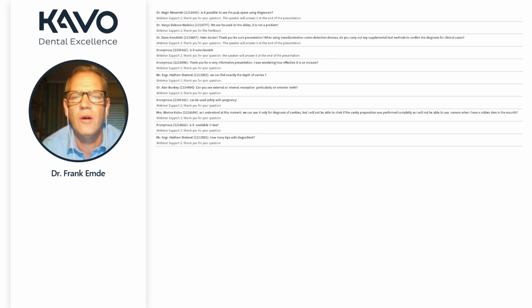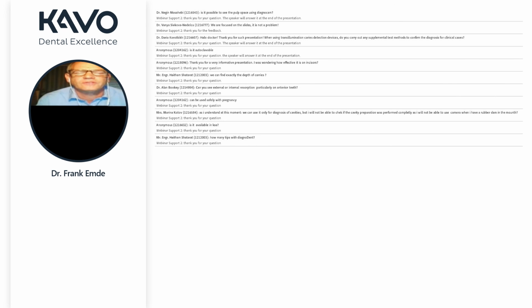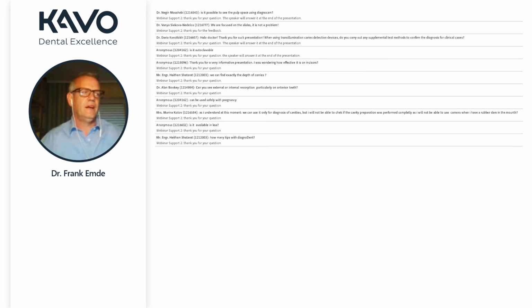As I understand, at the moment we can use it only for diagnosis of cavities, but I will not be able to check if the cavity preparation was performed completely. Yes, this is a good question. Can we use the Diagnostic to check our own preparation? Yes, we can do so. So if you have opened up the cavity, place the camera on site, and then you will see if you have excavated all caries.